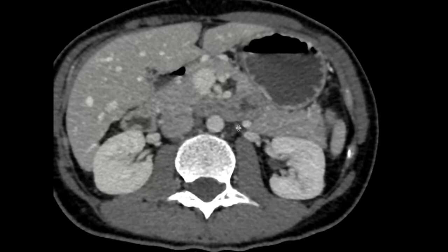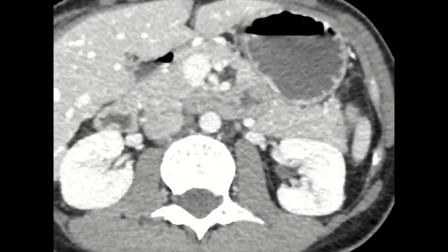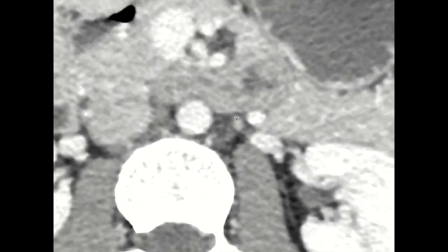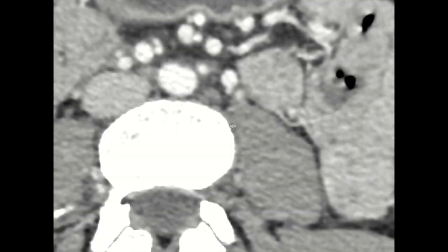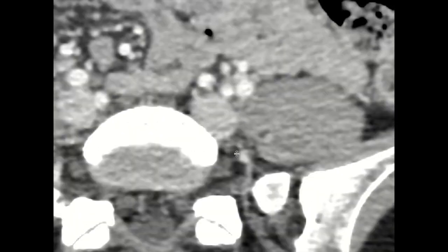We see this vessel right here — I'll zoom in on it. This vessel right here is your gonadal vein, and if you follow this vessel down it's going to take you to the left ovary. Here we can see it coming down and then going into this structure right here.